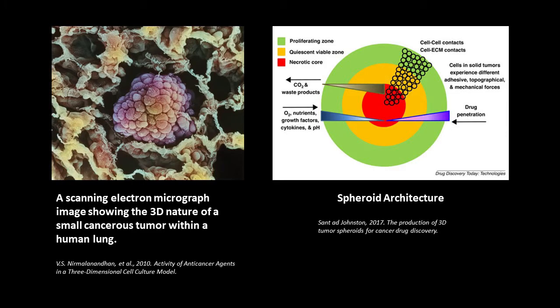So to kick off, Audrey, could you please tell us what is 3D culture and why does it matter? Yeah, so traditionally adherent cells have been cultured in 2D. So think more like a monolayer, they're flat, against something like a plastic or a coated plastic. In 3D culture, instead, the cells are grown more like in aggregates or clumps. So those cells in 3D culture are experiencing a different environment compared to 2D.